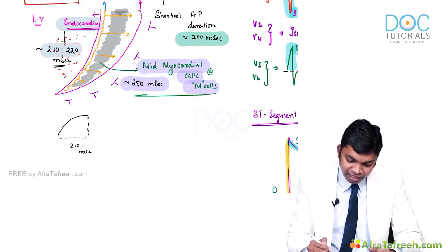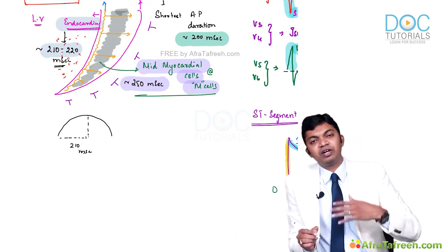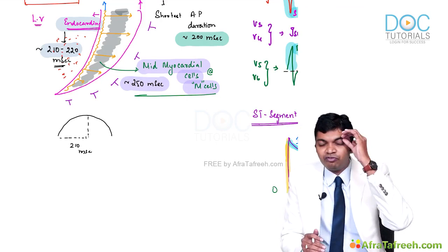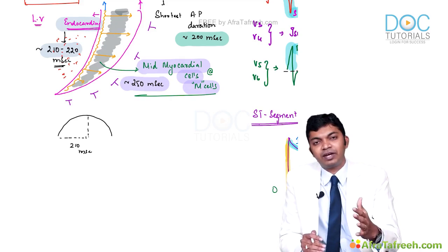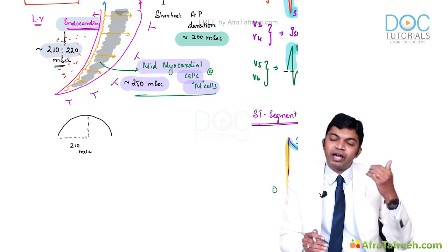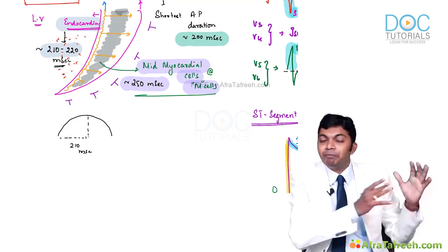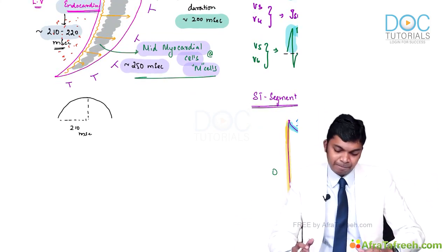So the second half of the T wave is due to traveling of current from the mid-myocardial cell towards endocardial cells, doctor. This is how the T wave is formed. You have an upstroke and a downstroke. Now, for heaven's sake, please remember, if a current is traveling towards the active electrode, ECG will write a positive deflection. If a current is going away from the active electrode, ECG will record a downward deflection. For a detailed understanding, I recommend you visit our basics of ECG videos so that you will have a solid and smooth understanding of ECGs, right?